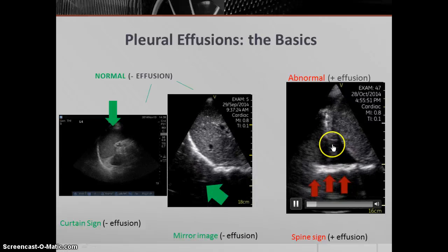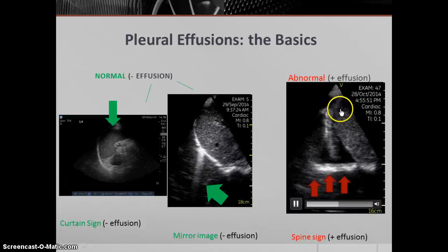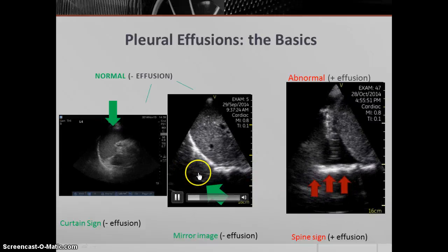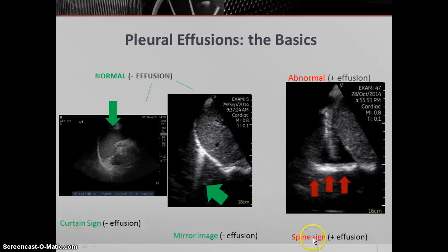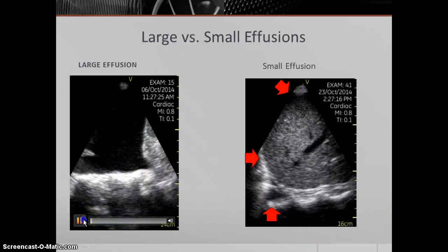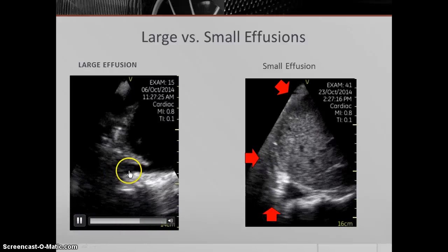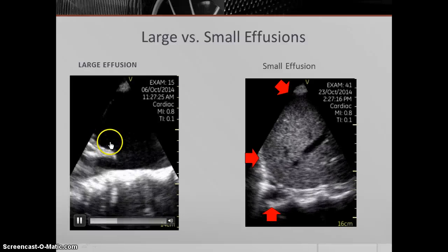This is what we call a curtain sign — when you have an air-filled lung obscuring the view of what's distal behind it. You can see the air-filled lung sliding in and out of view, causing a curtain that obscures your view of the spleen and diaphragm. That's an aerated lung with mirror image artifact. As the diaphragm moves up and down, it alternates between revealing and concealing the vertebral bodies with respirations — that's a mirror image artifact with no effusion present. When you have an effusion above the diaphragm, the ultrasound beams pass through the liver and diaphragm to reveal what's on the other side — you can actually see the vertebral bodies. That's a positive spine sign. You can have small effusions showing a tiny wedge of fluid, or very large effusions where you can see the lung floating in all that fluid.